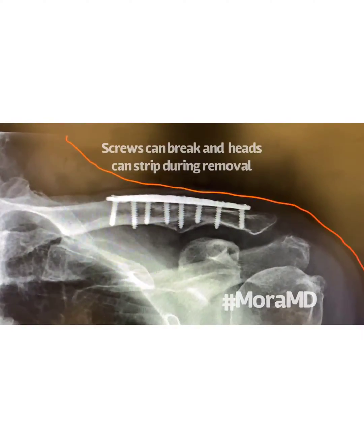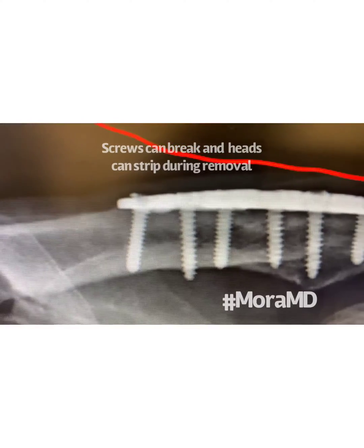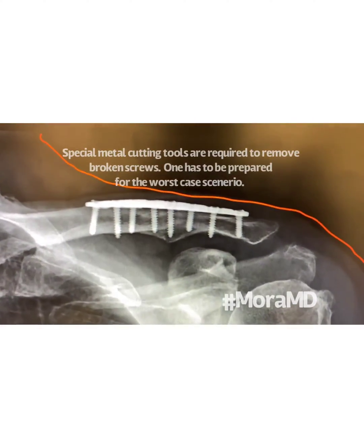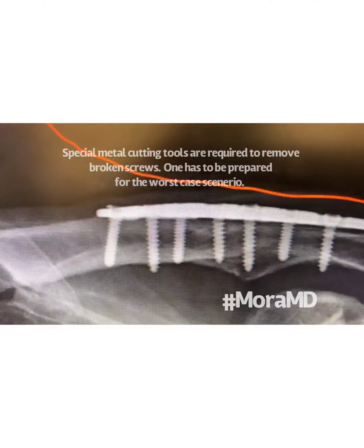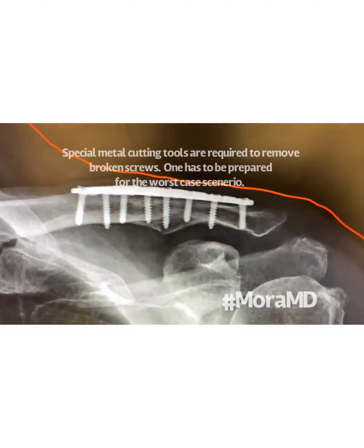Removing them is not so straightforward. Often times, these screws have become embedded in the bone. The bone basically grows into it, and getting them out sometimes is a little difficult. Sometimes the screw heads will break as they're being twisted out, or sometimes the screw heads strip.